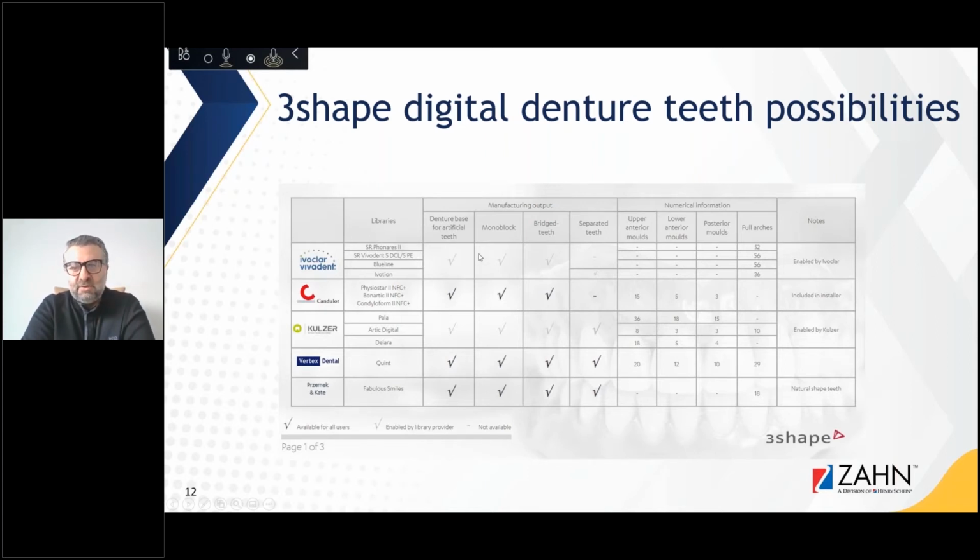Now we can do that for them with the permission of Ivoclar, and we also have the tendency to get in direct contact with them. But the most important thing is to actually communicate the dongle number where we would want to activate that library. Some libraries have fees behind it, but that's something that you can discuss with that specific vendor in question.